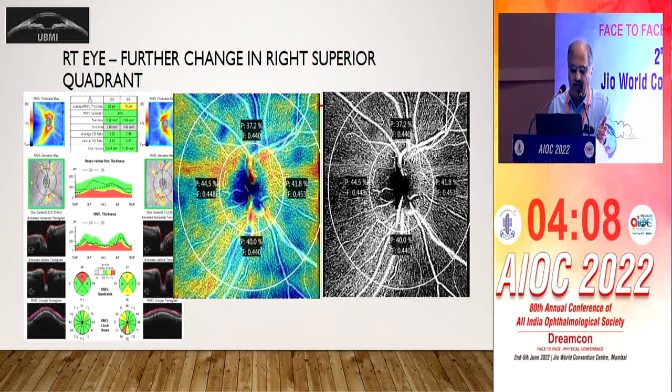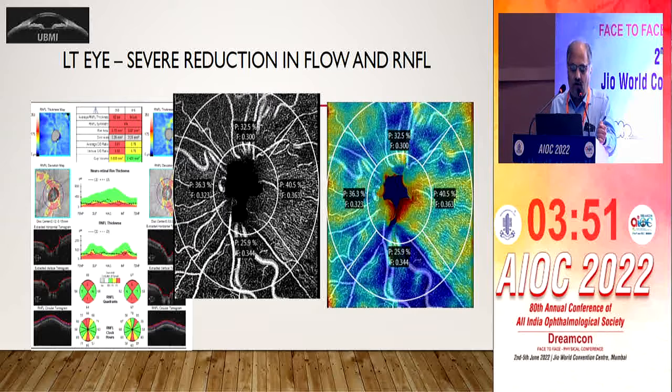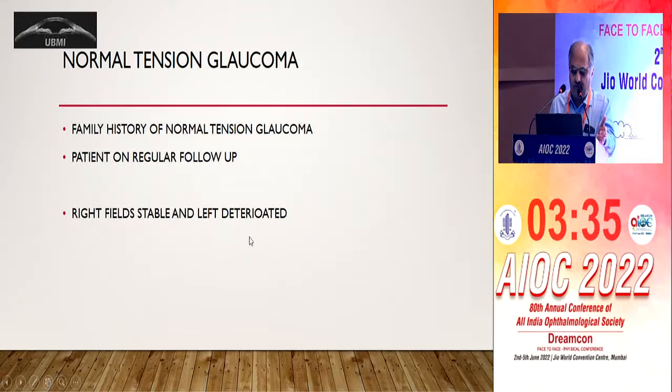Same patient, the other eye, you can see that there is a significant superior loss on OCT, and you look at the values here on the superior side, 37.2, whereas it is 40 point on the lower side, okay? So there is one more addition to our armamentarium. A severe loss of function on the left side with 67, 68 here, and you can see that there's almost loss of the capillaries along the arcades. Even the superficial plexus are gone. Therefore, we are seeing this white hue, which is actually the deep plexus coming up. So values are 32 and 34.